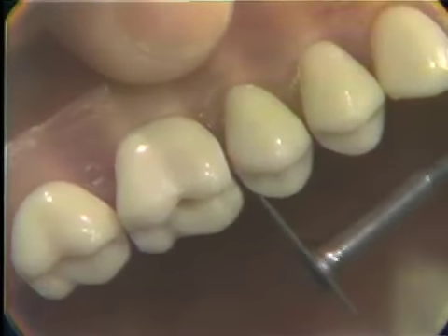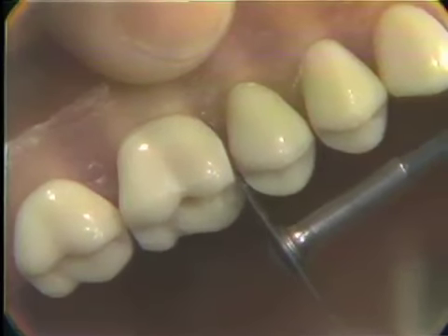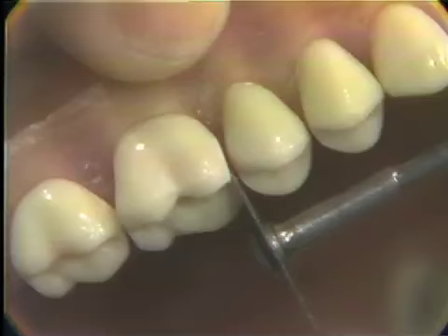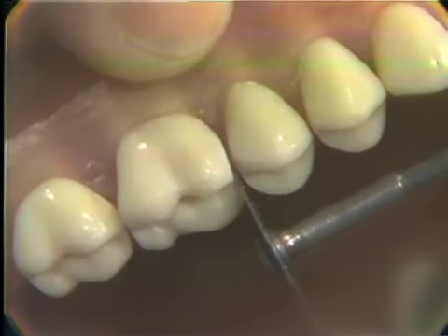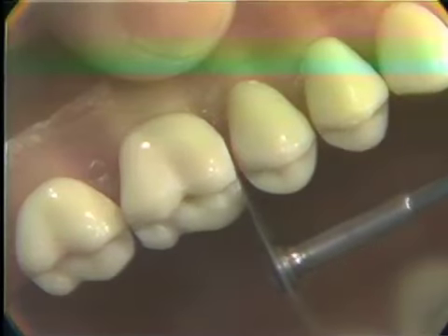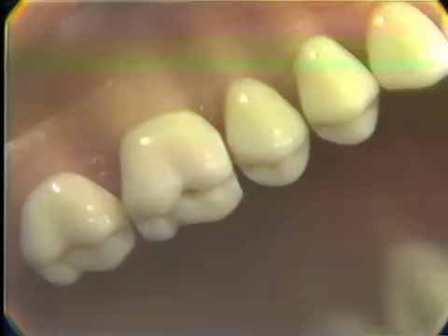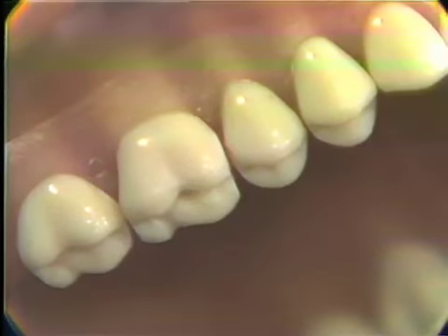We'll change our head position, not of the patient, but of yours, so that you can see between the tooth and the disc, placing the disc again to the cervical extent that you wish. Then, without moving the disc, you start revolving the instrument and pull it to the occlusal. That is probably the full extent of the slice.